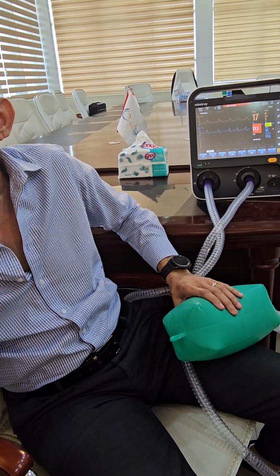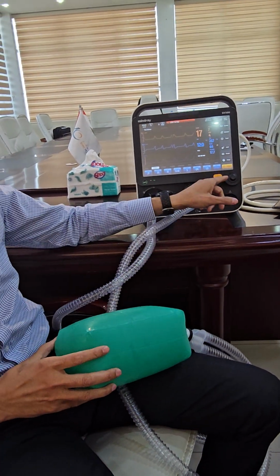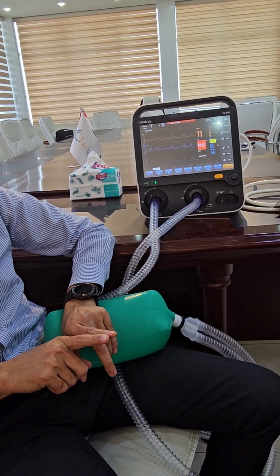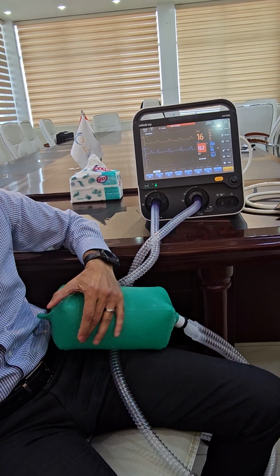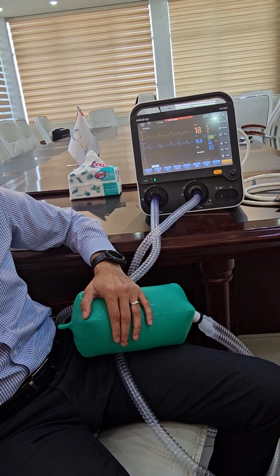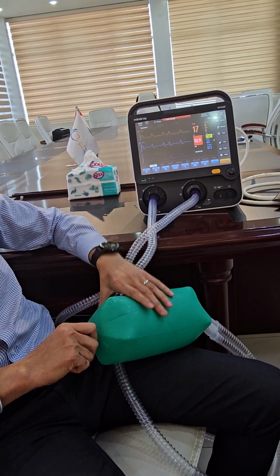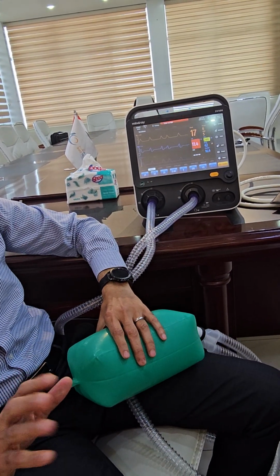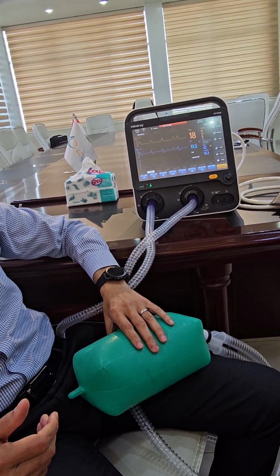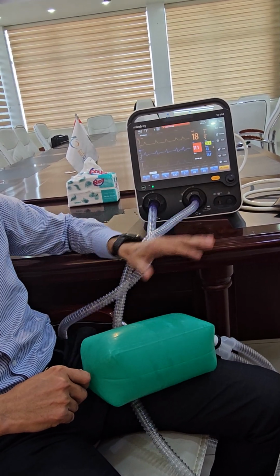So what you should do is always give room air. But if we need more, what will you do? You will give oxygen, and then you should have an air-oxygen blender. That's why there is no oxygen without an air-oxygen blender. If you remember the oxygen delivery: humidified, heated, and blended. So always start with room air. Now, you have a target saturation on the monitor, and you need to achieve it always. So temporarily you can increase until you come and discuss what the problem is. Is it improper sedation? Is it improper analgesia? Is it the wrong mode?